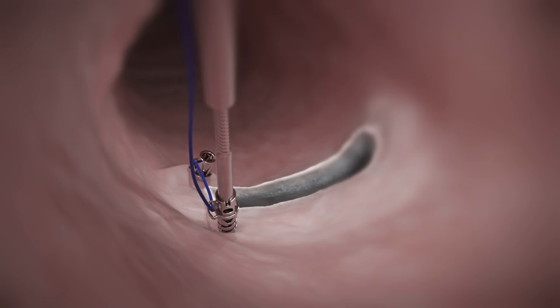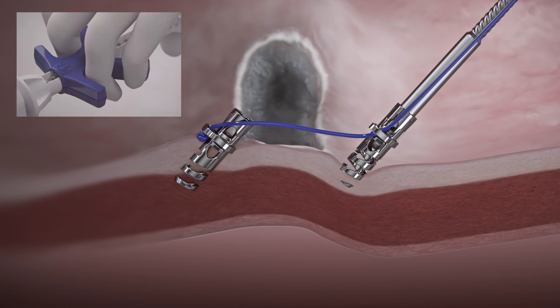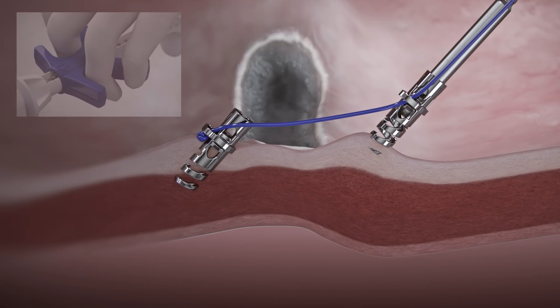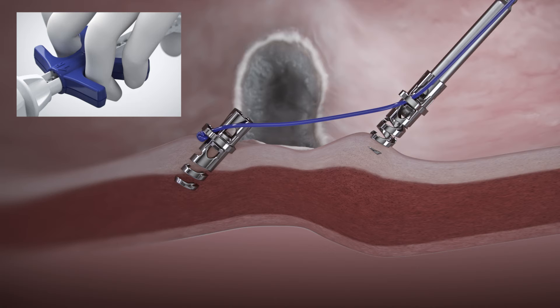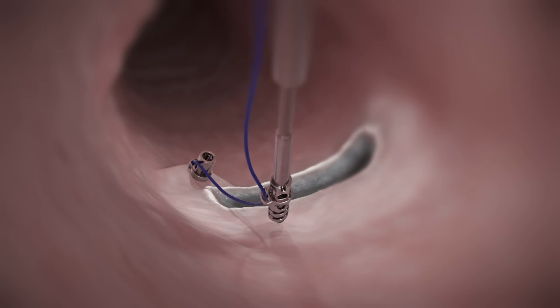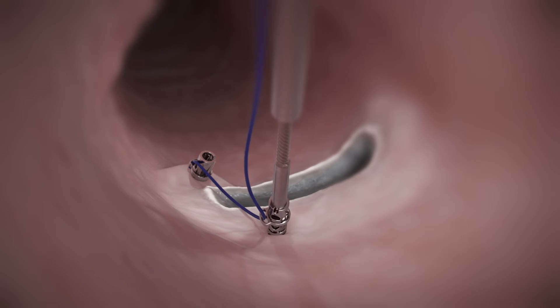Maneuver the scope and target the second position. Verify position before fully driving into tissue. If position is not optimal, reverse the helix TAC by gently pulling back on the catheter while pushing the handle slider to the R position. Reposition and repeat the technique to place the second helix TAC.